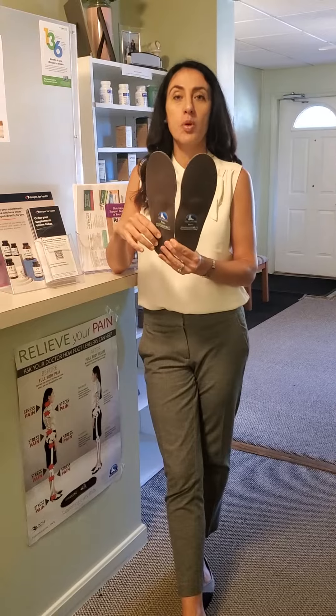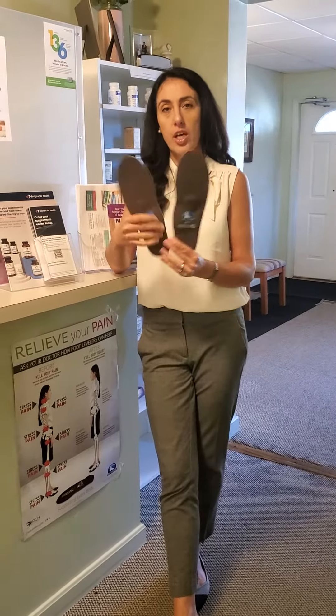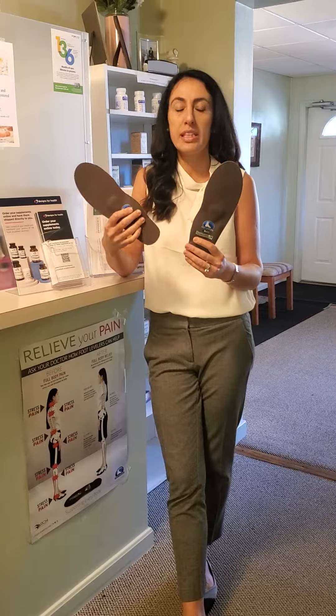This is Dr. Natalia Kerridge from Cumberland Family Chiropractic. Today I want to touch base about in-motion orthotics by Foot Levelers — what makes them so special and why would we need them?